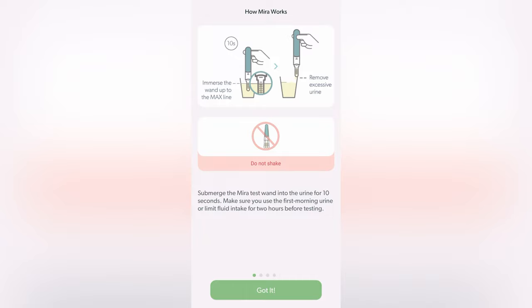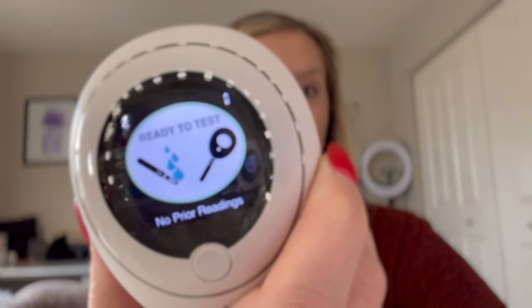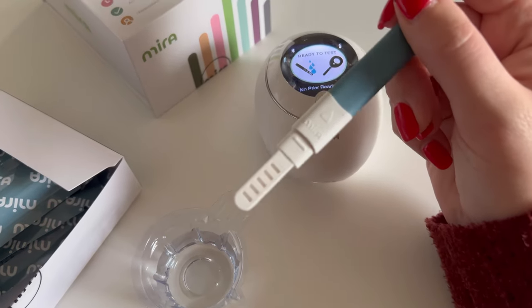Once your Mirror Analyzer and your app are configured, you'll see instructions on how to start testing. Once I configured my Mirror Fertility app, my Mirror Analyzer will say that it is ready to test. So I took out one of the test wands.